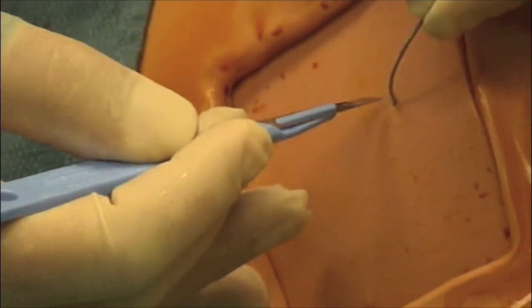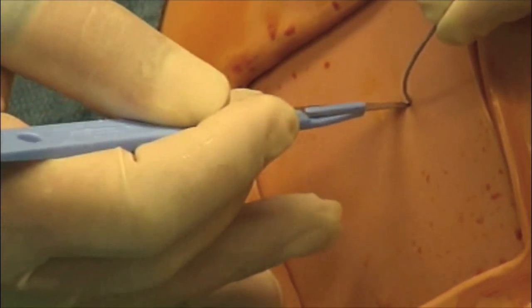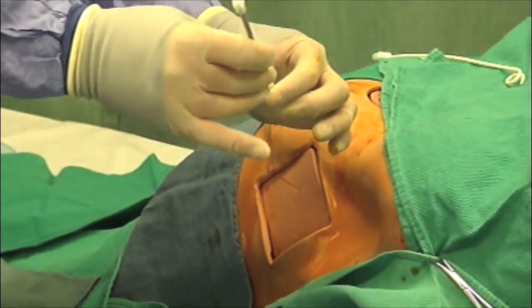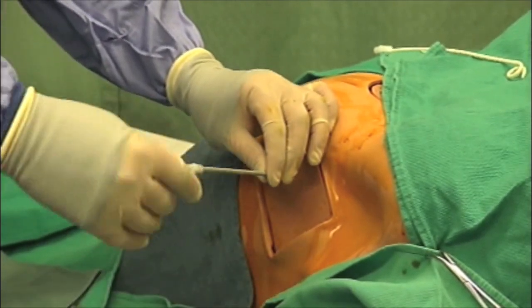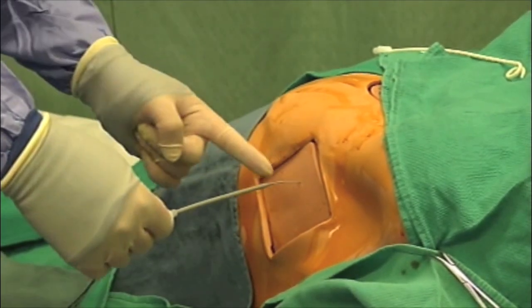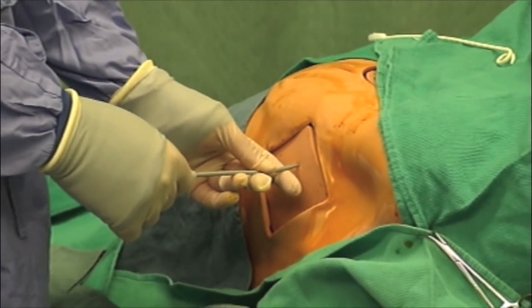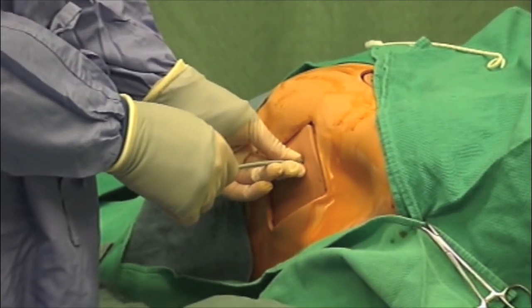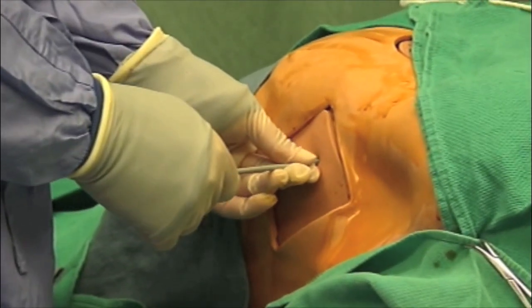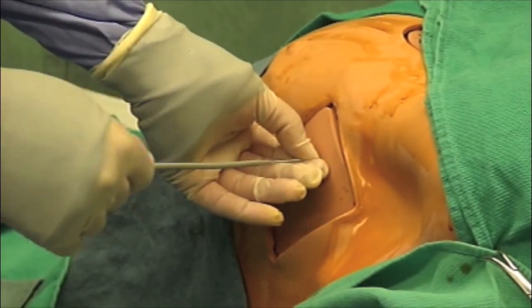Pierce the skin adjacent to the guide wire with the scalpel. Thread the dilator over the guide wire to the depth determined by the seeker needle used for local anesthetic. Remove the dilator, leaving the guide wire in place.